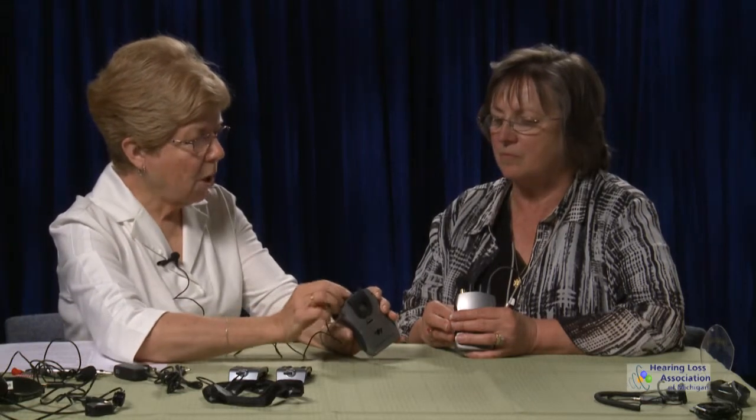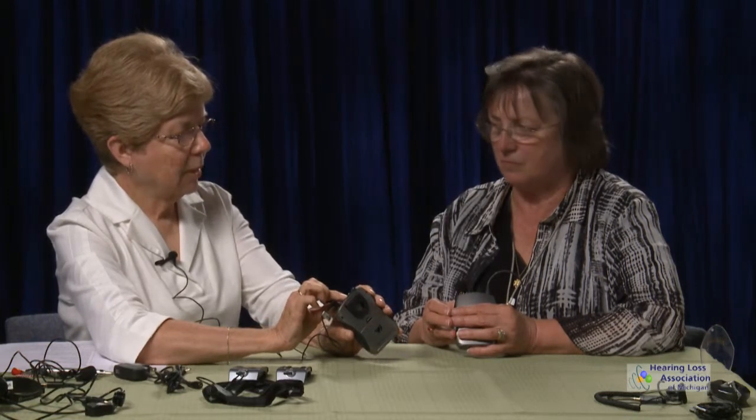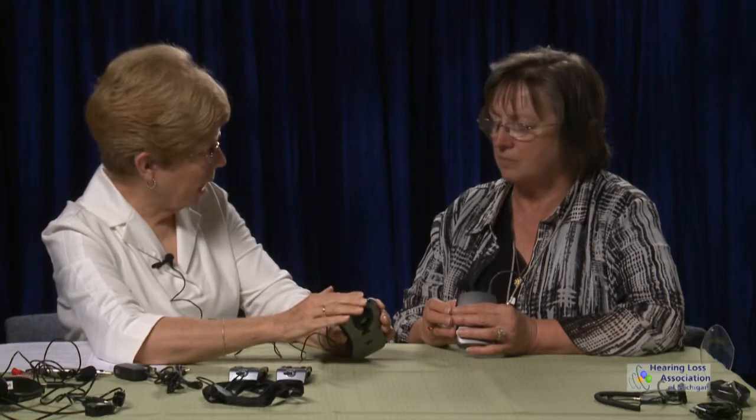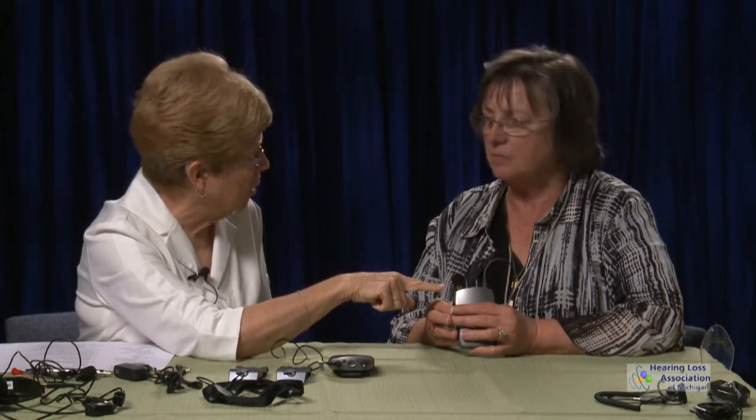The other beauty of this particular piece of equipment is that I can turn off the transmitter, and hold it down. It went on standby. If you push down and let up quickly, a red light flashes. That means you're on standby. If you push for about 3 seconds, then the unit goes off. But you're still hearing me, right? Because you're picking me up through the environmental mic. So this device can be used as an FM system or as a personal communicator. It's like purchasing 2 devices in one, the personal communicator and the FM system. Do you have any questions about this device?